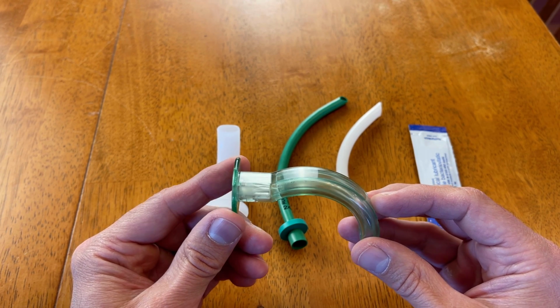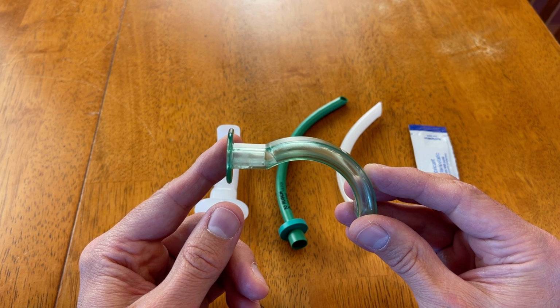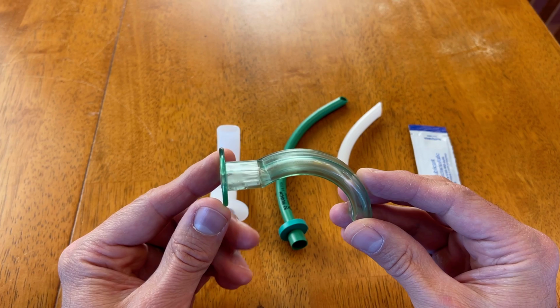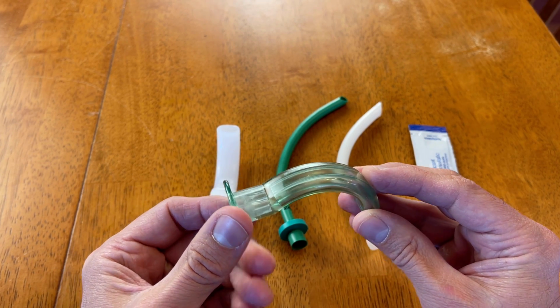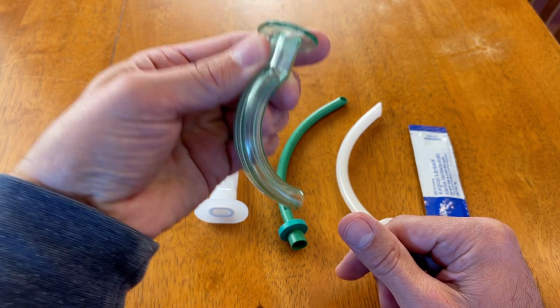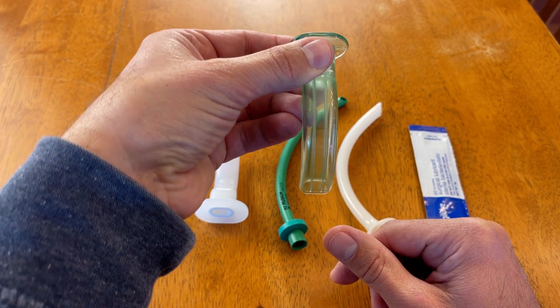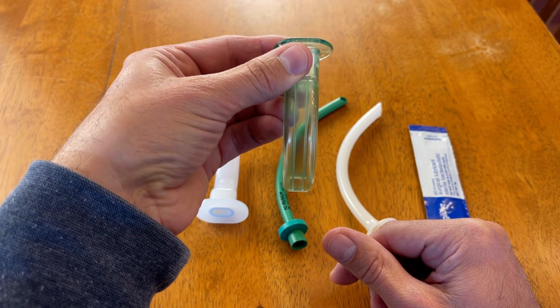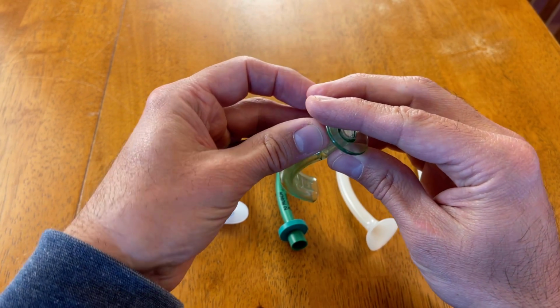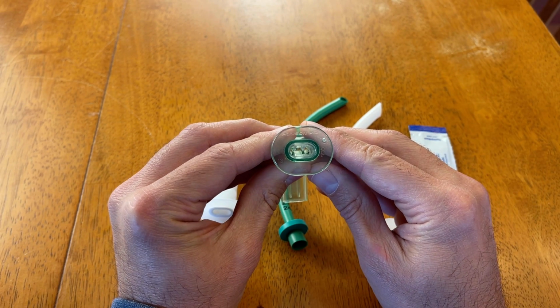Now, when it comes to insertion of an OPA, there are a couple of basic techniques or approaches to how to insert these devices. The first and most common one is that when you open the patient's mouth, you insert it kind of upside down. The reason for this is you're going to try to move this around the tongue. Once you get past part of the tongue and that hard palate, you're going to rotate it midway through so it sits properly in the airway.